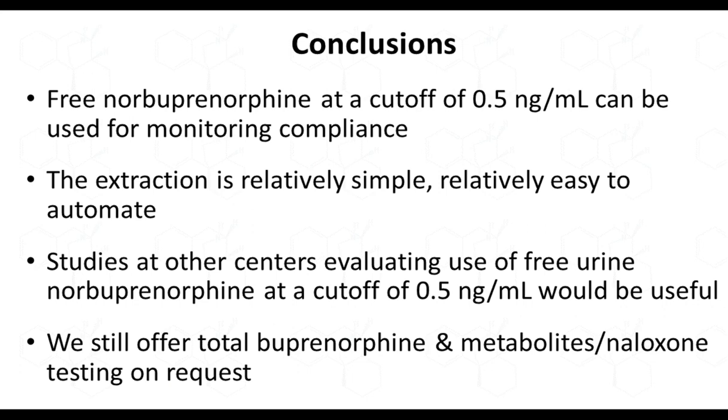And as I said, our solution, which we validated, has been successful by diluting it. Luckily, these samples are positive, and they're quite positive. So our quantitation is fairly similar in those samples that we dilute and then do not see the matrix effect. But we still are performing the dilution.